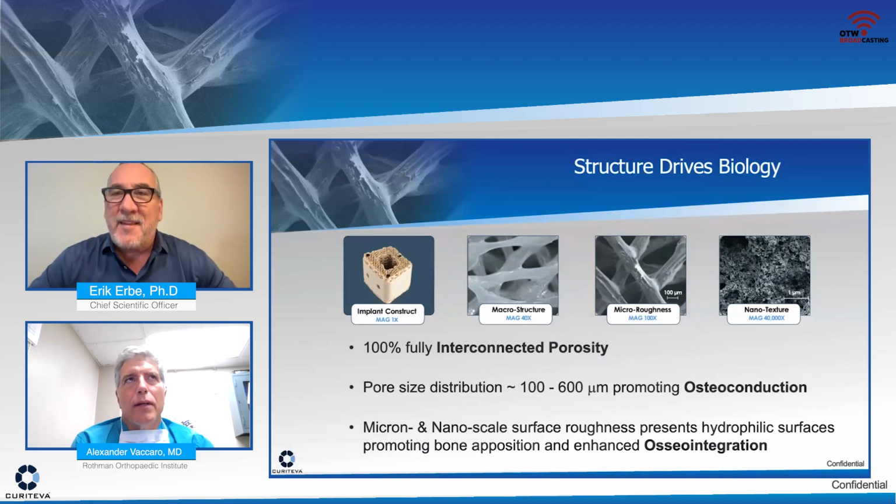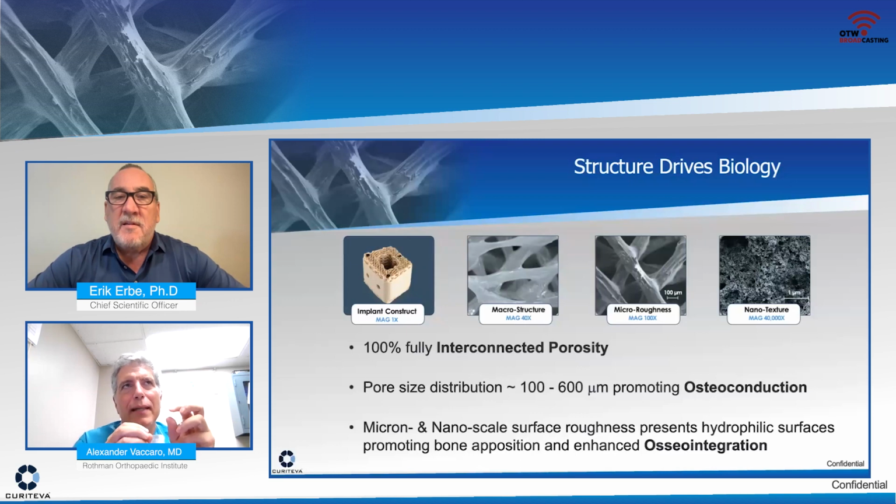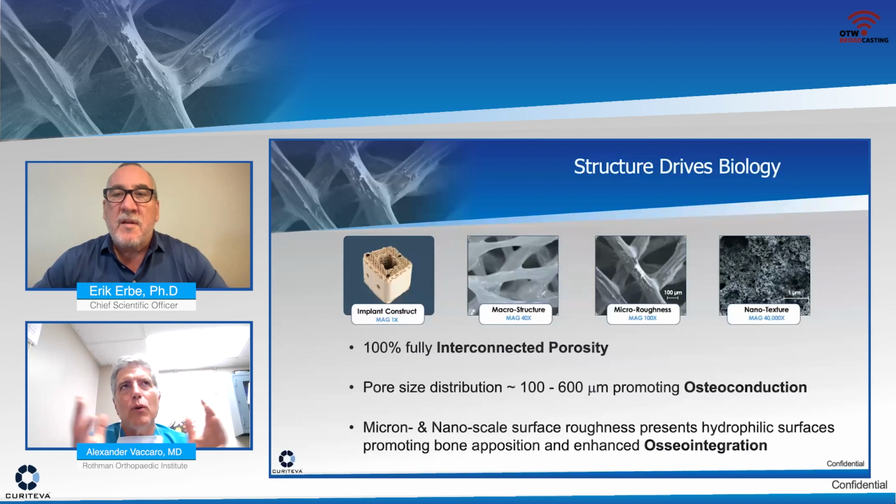So the things that you want in an interbody implant. We've already talked about the fact that I like it to be invisible. I like to be able to see the bone that grows through it. Other things, I want to make sure it's stable, so I need to have a roughened surface. If you look at the macro structure and you look at the micro coating, we see two things. We see that HA permeates throughout the entire implant. It's not just on the surface. It's not going to be flaked off when you place the interbody spacer. It has sort of the acicular whiskers of the HA on the surface, so the bone cells and whatever cells like to oppose to the surface, we call it osteopromotive.